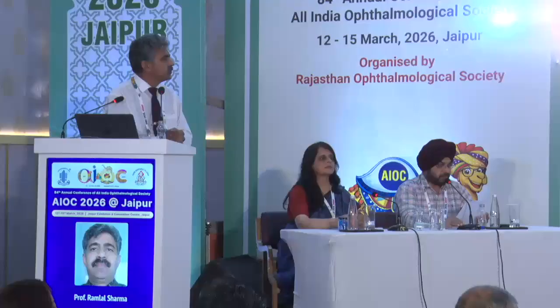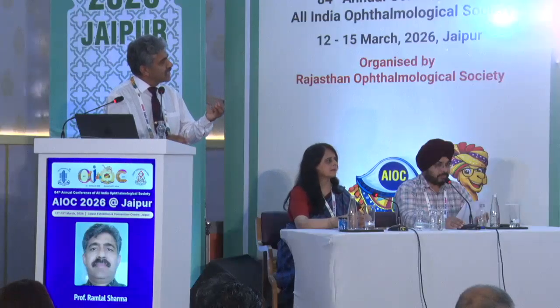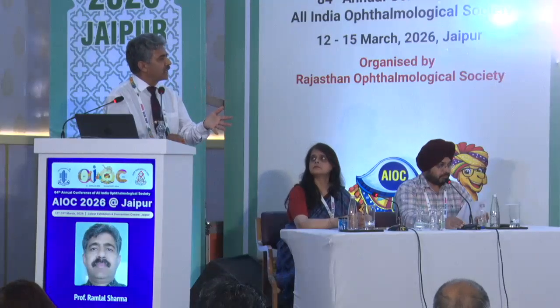And secondly, the beauty of this procedure is, there is no mark. Once you see after 1 week or 2 weeks, you can't make it out whether it is a SICS or phaco. Any time you can convert it. Yes, sir. And your conjunctiva is totally preserved. Yes, sir, you're not dissecting it anyway.